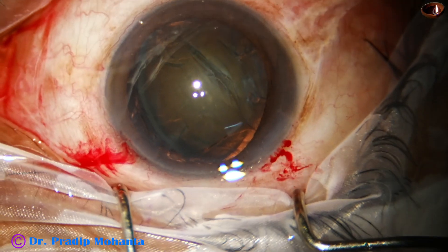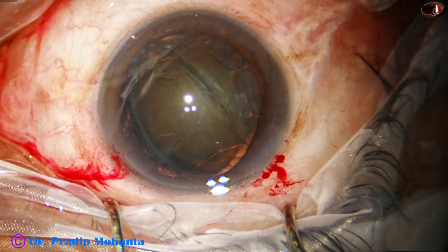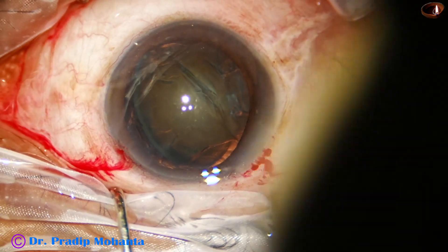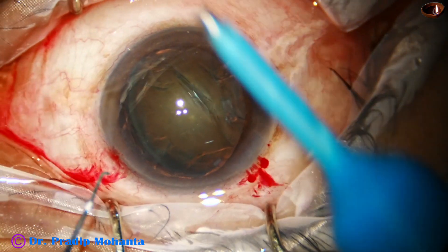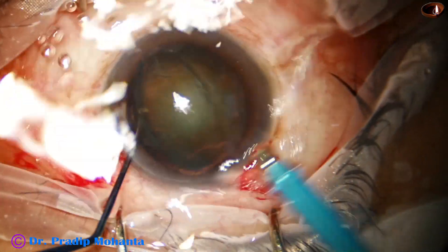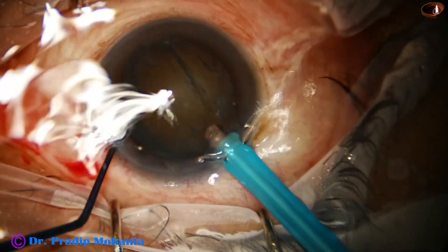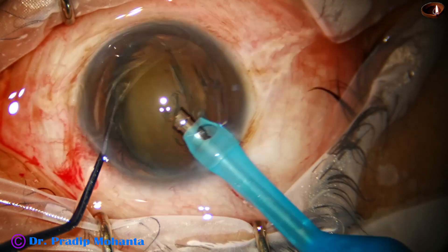Now the handpiece is to be introduced. The side port also goes in, and the side port supports the posterior surface of the prolapsed nucleus — the posterior surface — like this. Now the handpiece goes in and is turned.